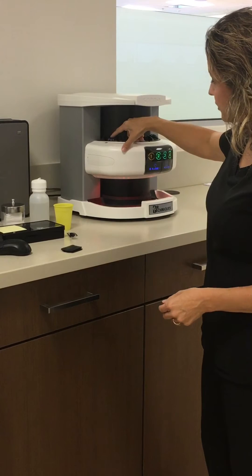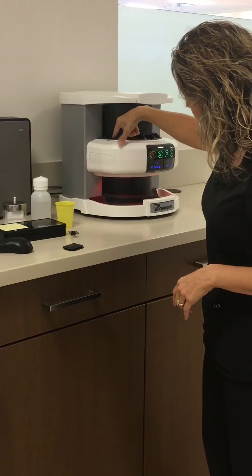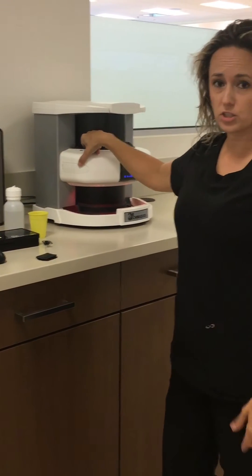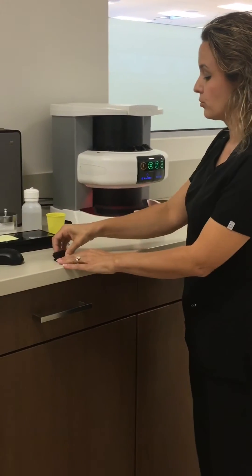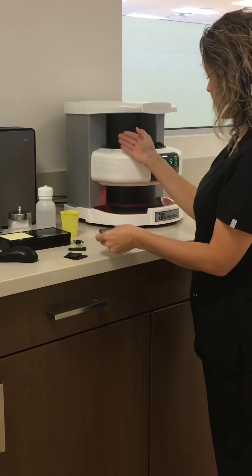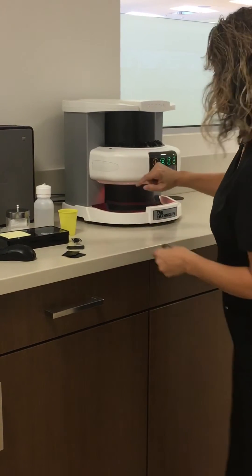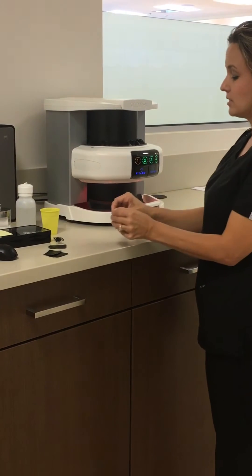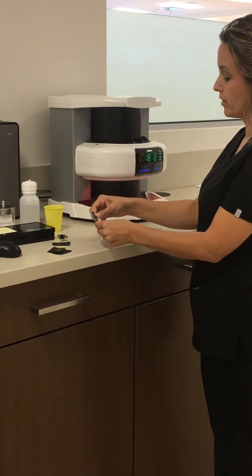Make sure the plate is very even across. If you scan it uneven, there's nothing we can do to straighten that image up. Apply gentle pressure so that it will draw the plate down in. While this one is busy, it turns yellow. As soon as that one turns green again, that means it's ready for another plate.